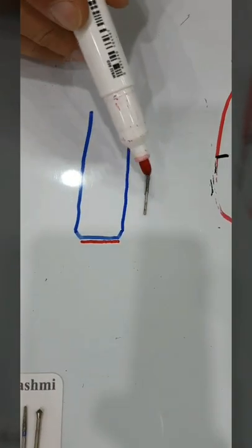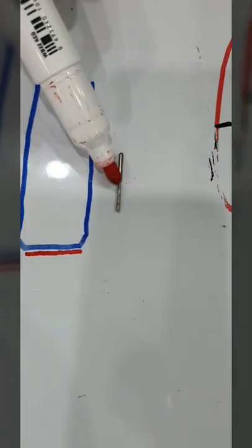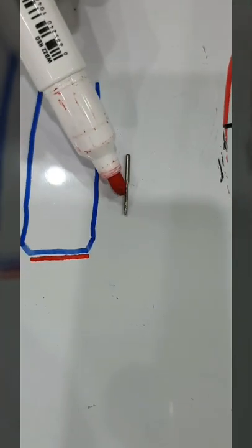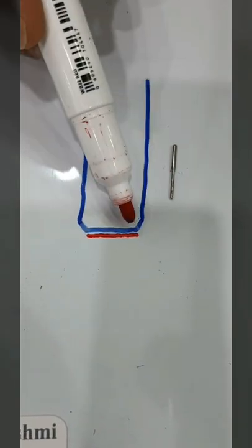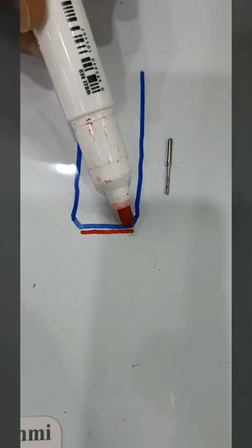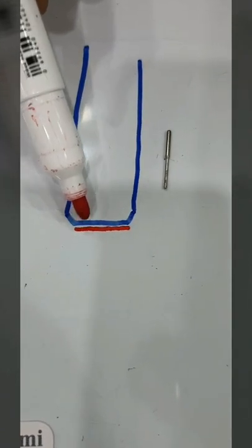To finish the margins, here is a long shank burr. It's fairly long at the shank right here. There's no diamond attached to the whole shank anywhere. At the tip you also have 2 bevels, so the tip becomes thinner, and at the tip is where the diamond particles are, and they're fine diamond particles, not coarse.